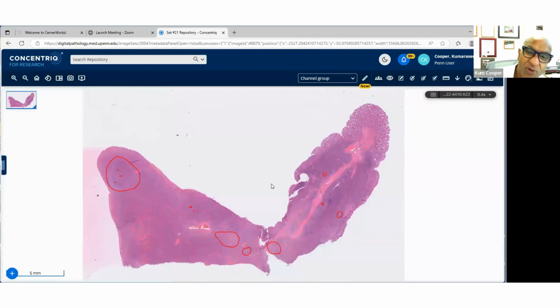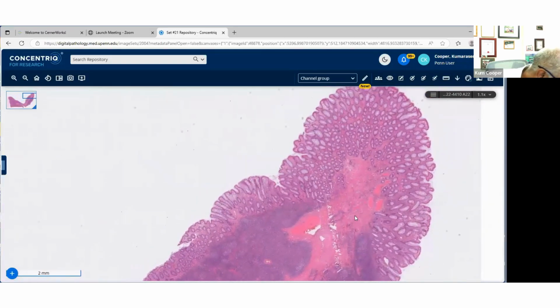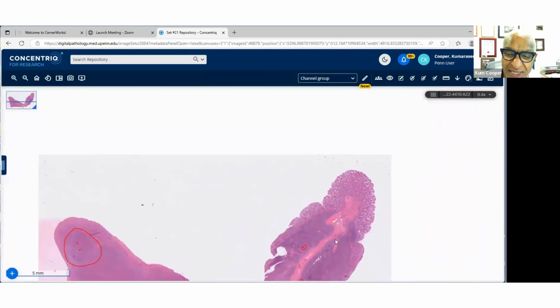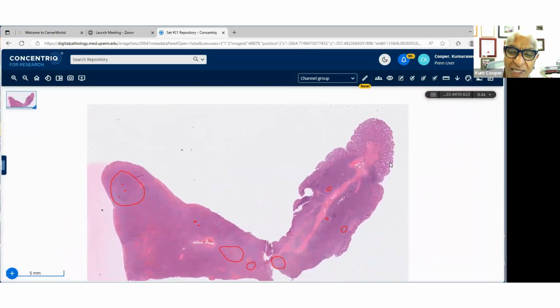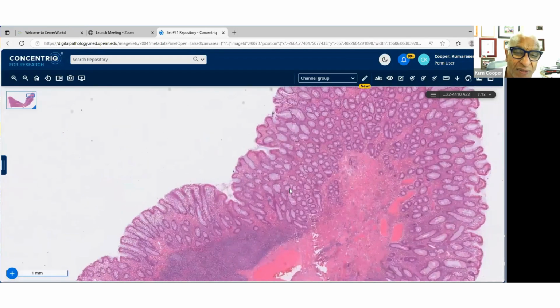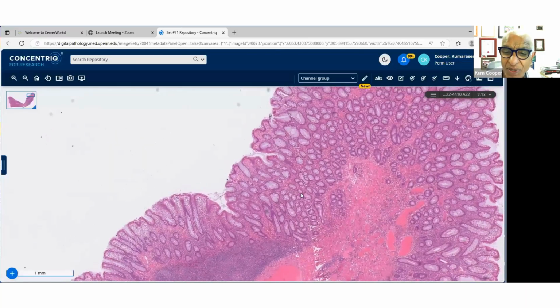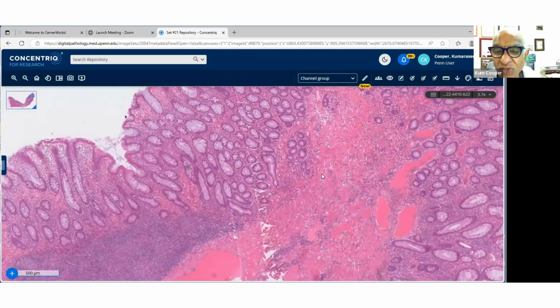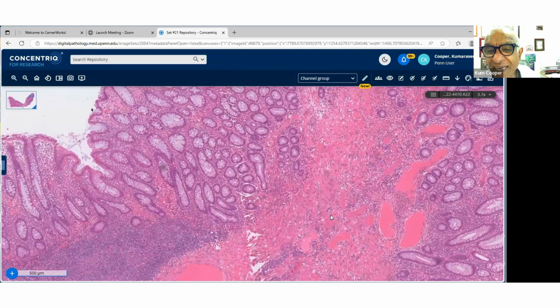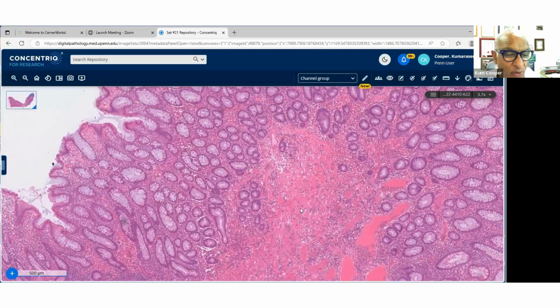So you've all spotted the colon here. I'm sure you've all spotted the colon. What's this guy doing with colonic polyps? 46 female, and that's what this is. This is a colonic polyp. You can see the polypoid nature of it, the surface of the mucosa on that side. And I'm just going to go down for you just to appreciate, yes, there is a colonic mucosa. There's a submucosa. It's a normal sort of submucosa, a little dilated, ectatic lymphatics, some inflammation, likely because it's polypoid.